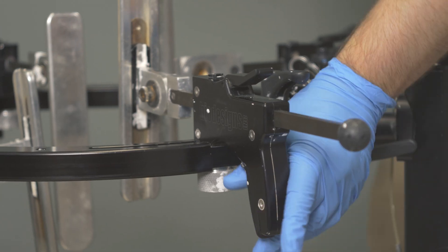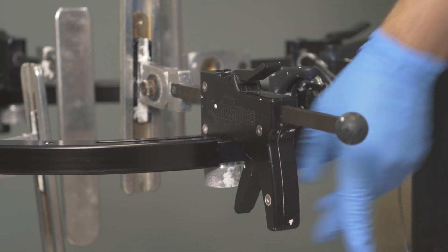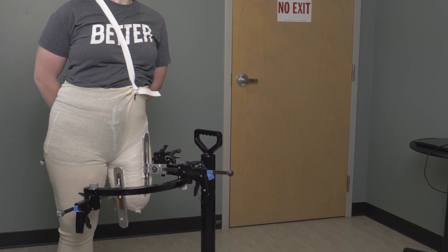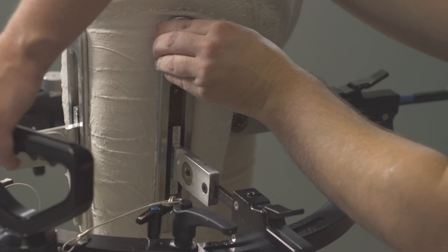The casting stand and paddles can be positioned flexed or extended to match the patient's resting angle. While the plaster is hardening, it's important to have the patient fully load into the paddles to give a realistic sense of the load they will be experiencing inside the socket.